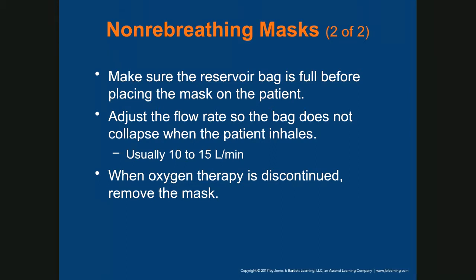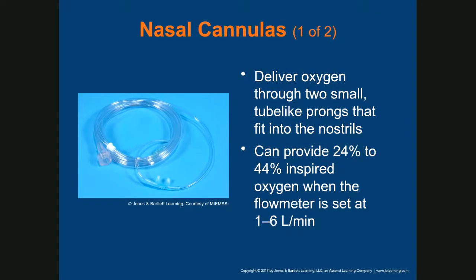Okay, good. Now, nasal cannula, a low flow device. It goes into the nostril, and you're looking at 1 to 6 liters per minute, right? 1 to 6 liters per minute.